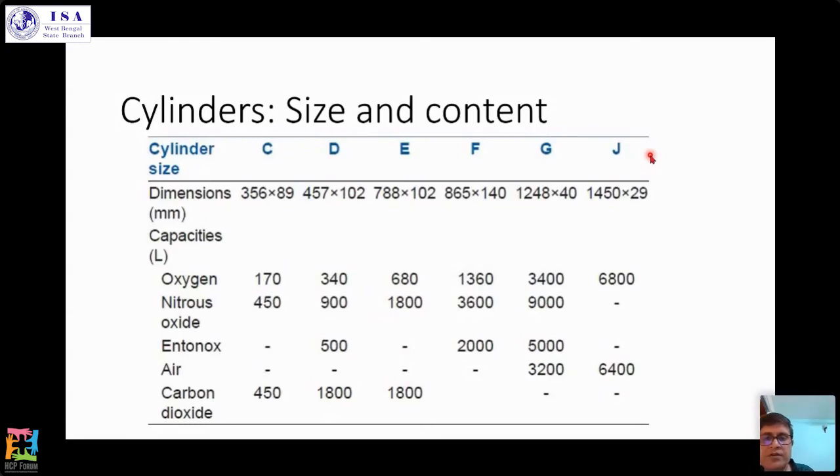Cylinder sizes and contents. I have a confession to make: I find this thing extremely confusing. I was trying to find a universal solution to this, because everywhere there are different values. The supply of medical gas in India is now done solely by a single company. Previously, it used to be British Oxygen, BOC, and there is one US company.